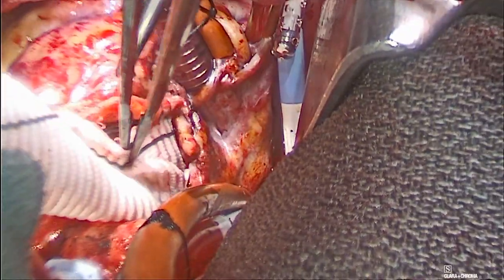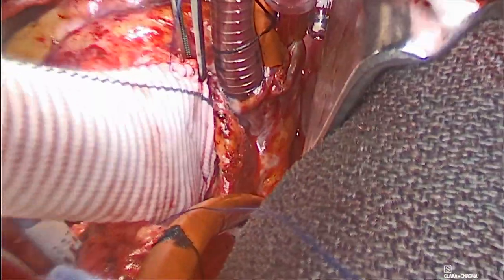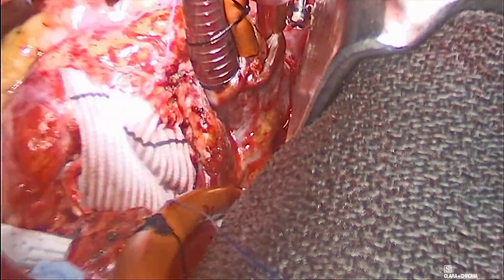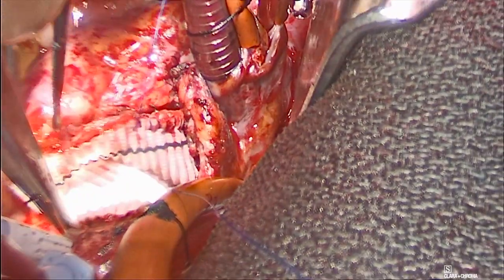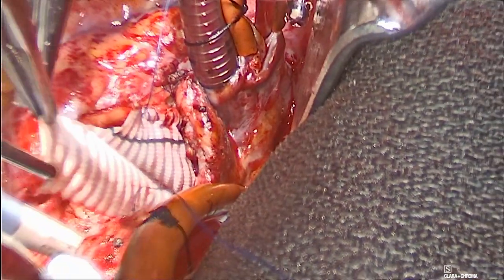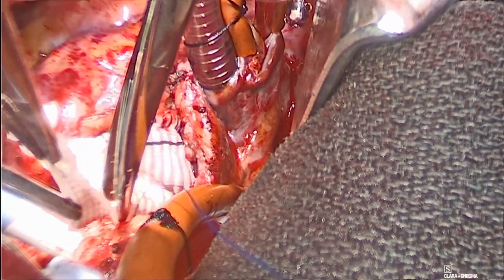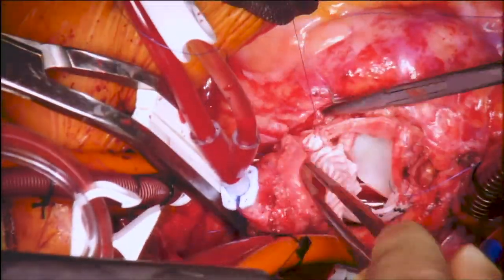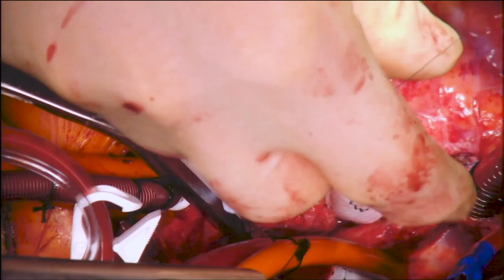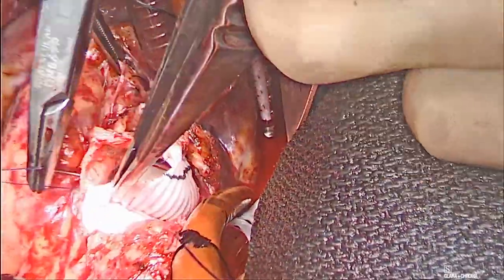The patch was sutured to the remaining part of the aortic wall and tailored in a tear-drop shape fashion to complete the closure of the aortotomy. A stitch was started from the other side of the aortotomy to incorporate the patch into the aortotomy closure, as illustrated, from both sides of the patch.